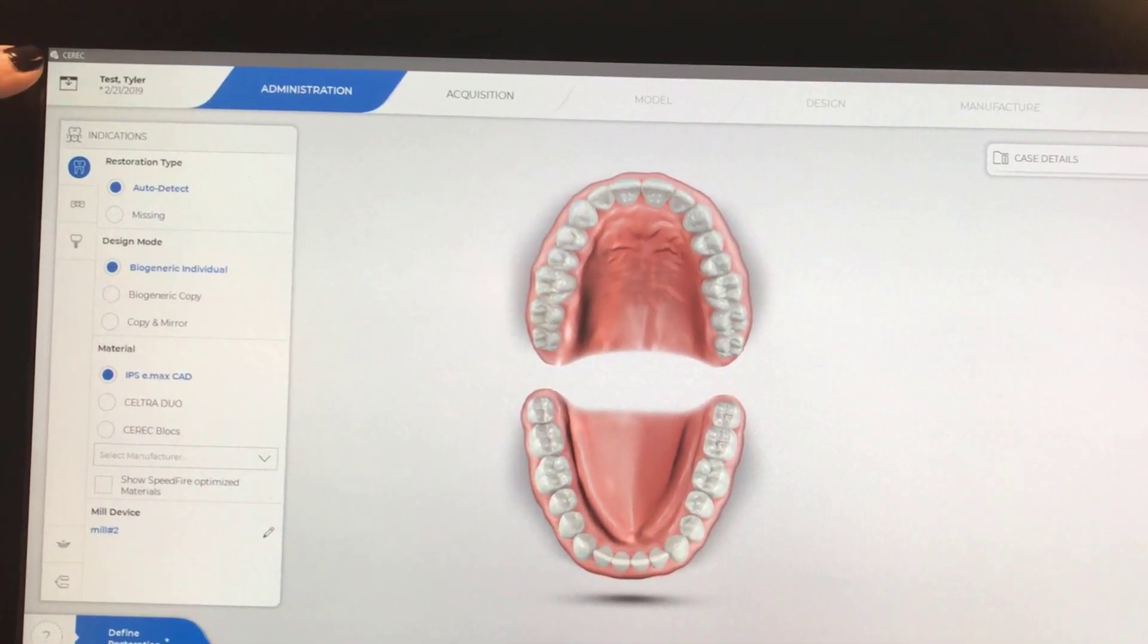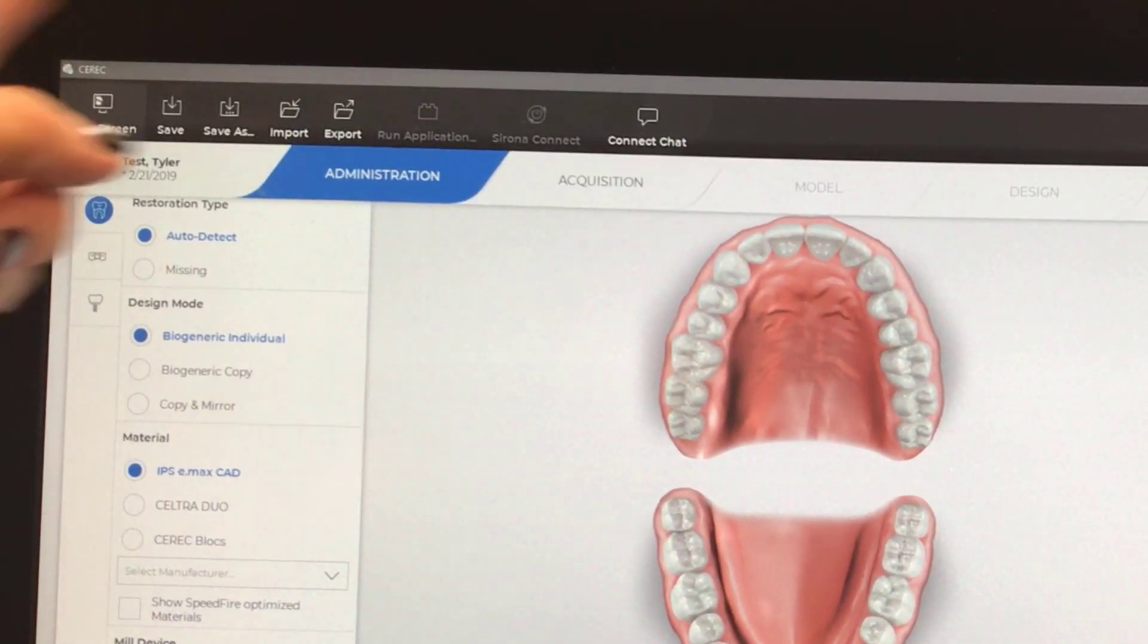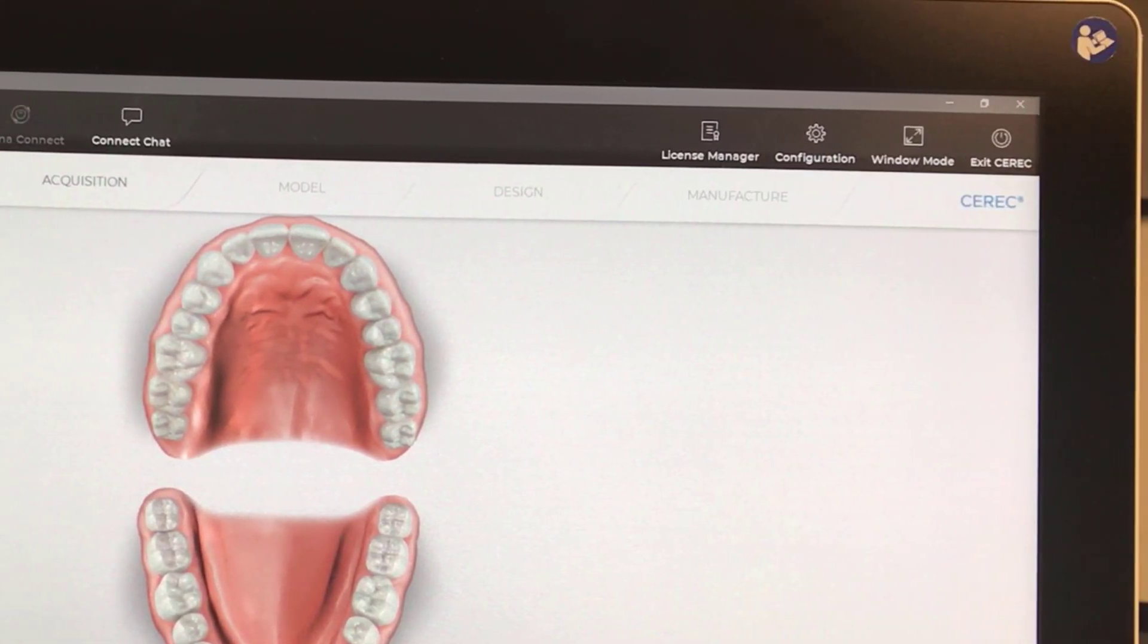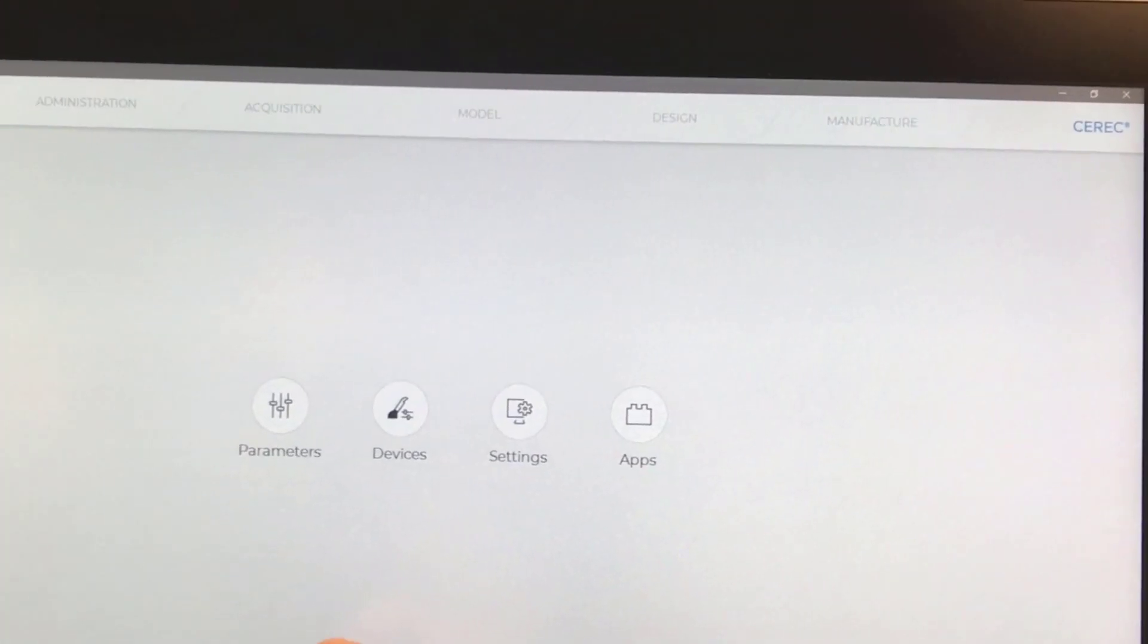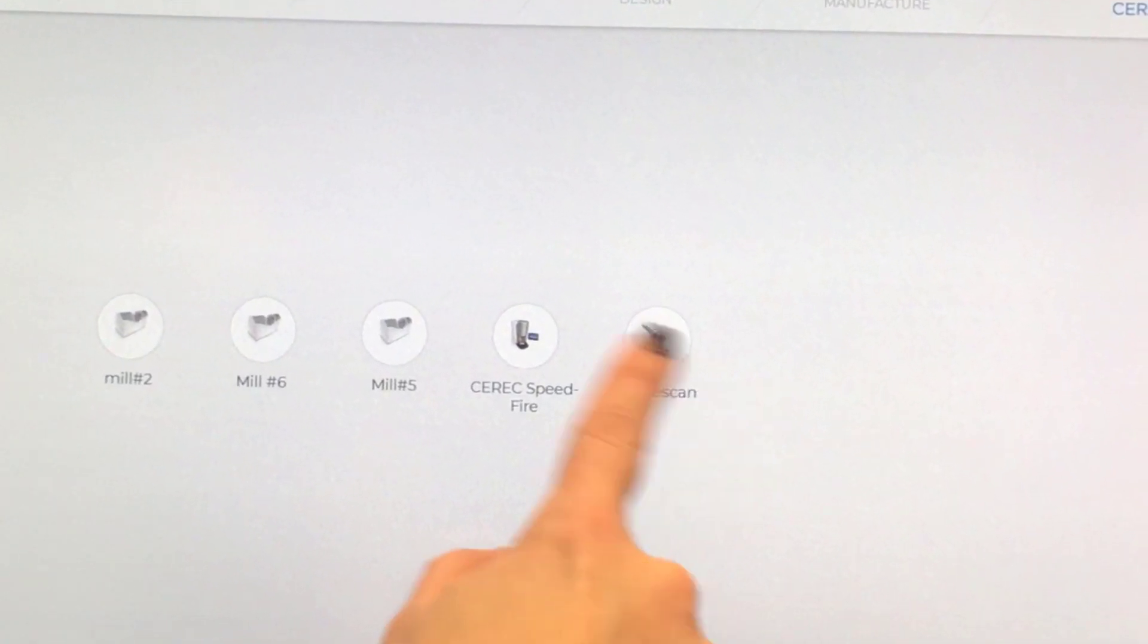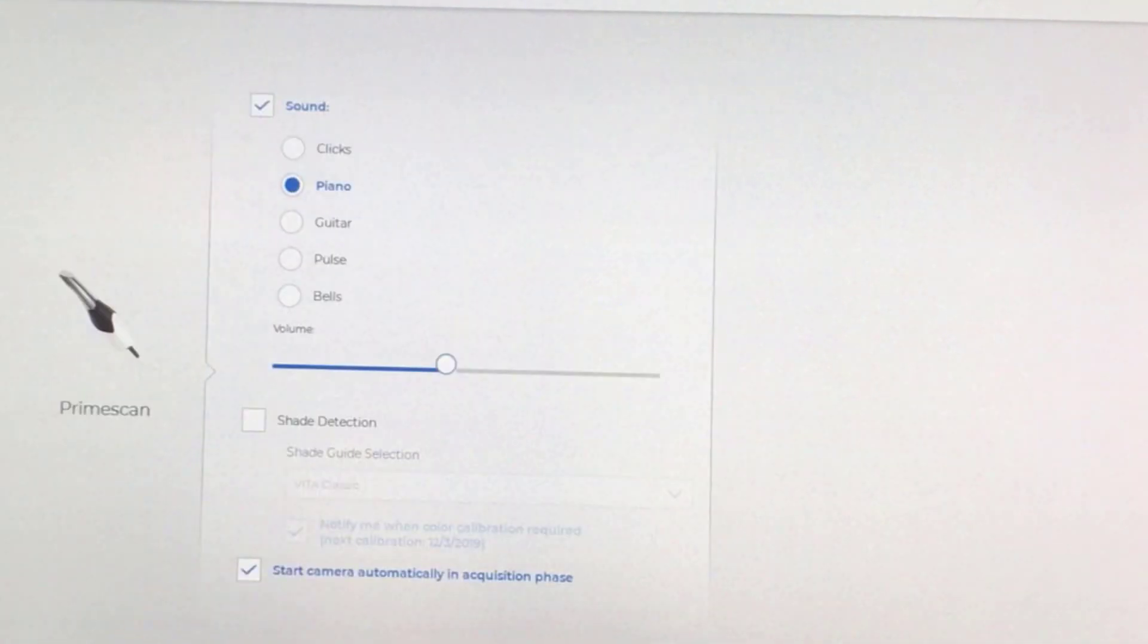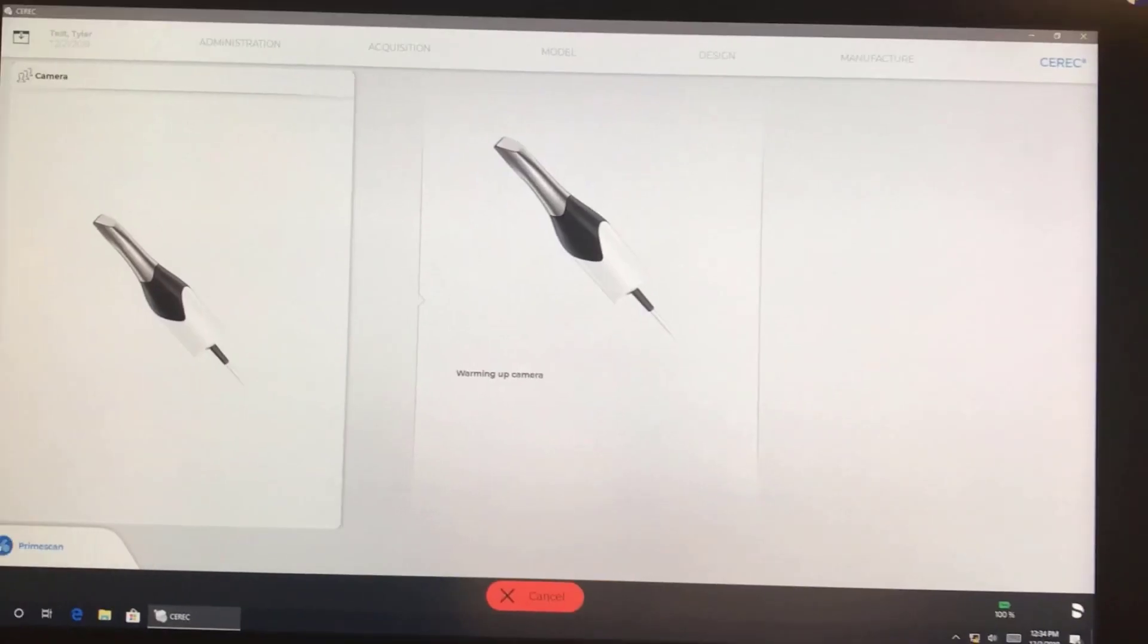We're going to click on the drop-down menu. We are going to go here to Configuration. And then we're going to click on Devices. And we're going to select our PrimeScan. And on the bottom here, we have Calibrate.